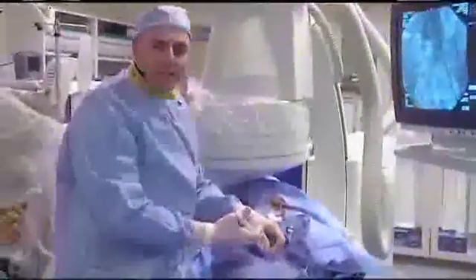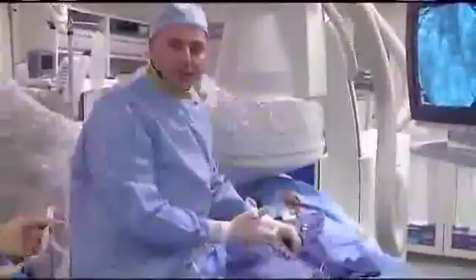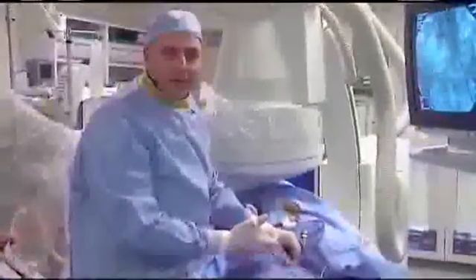Typically, I like to check the ACT every 20 minutes. Our range of ACT should be between 225 and 250. I'm going to take a picture with both sides so we can identify how long the stent is that we need.